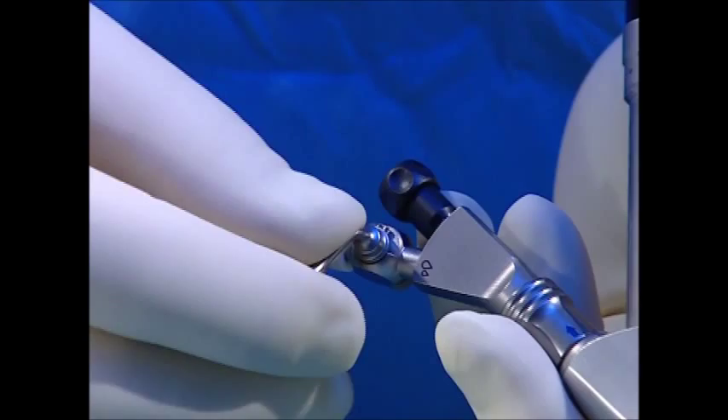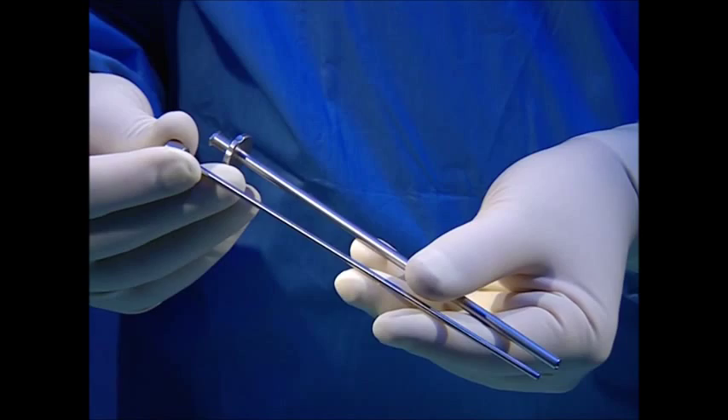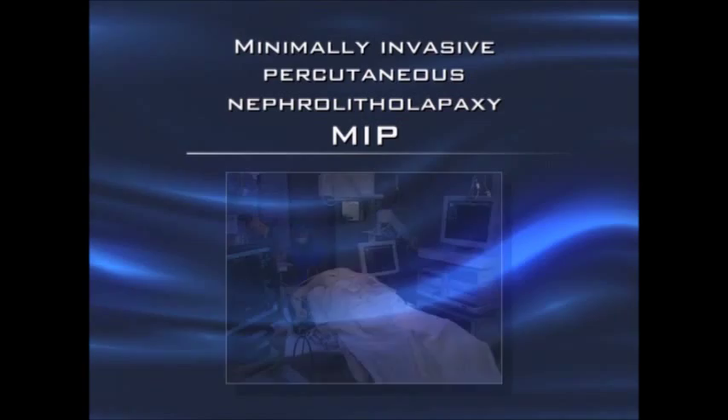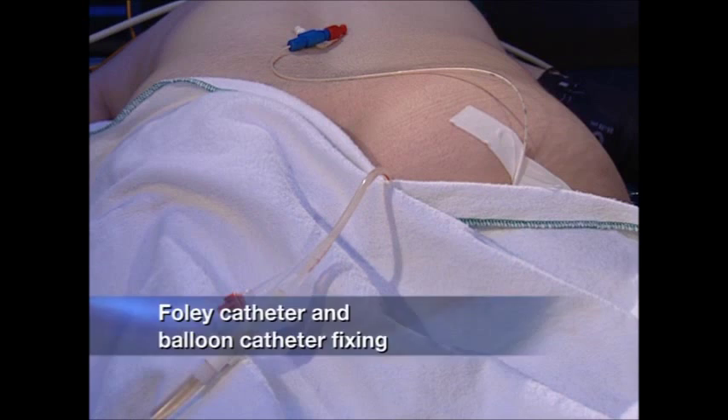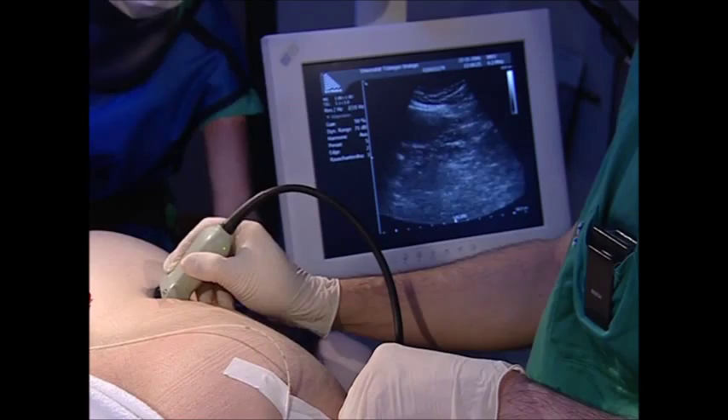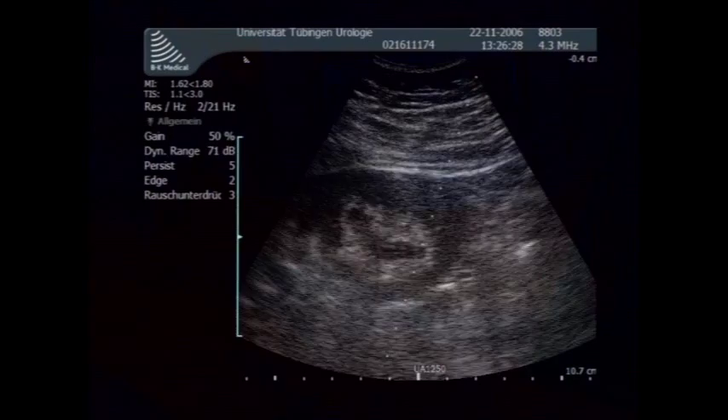A radiopaque applicator with obturator can be used to introduce haemostatic agents. The Foley catheter is connected to the urine bag and the balloon catheter is fixed to the buttocks under slight tension. Before draping the patient, optimal positioning is checked again using ultrasound and the ideal puncture point is marked on the skin.